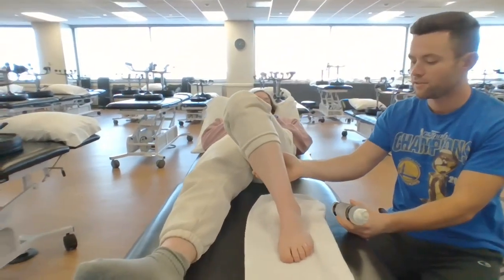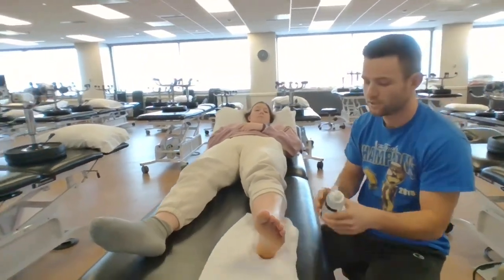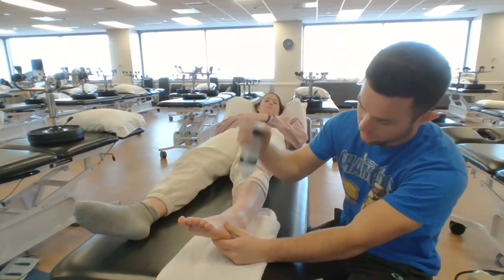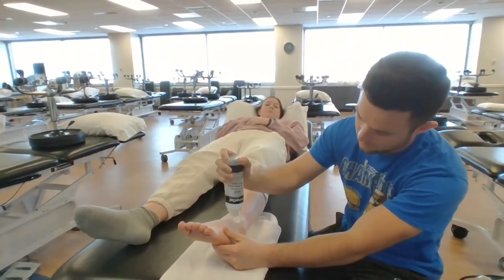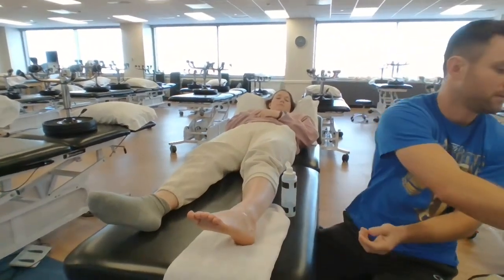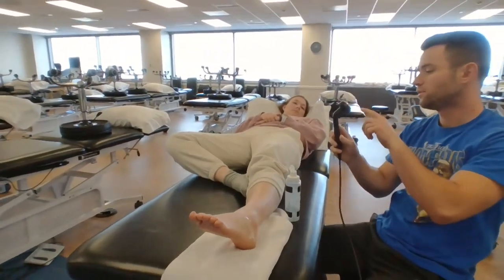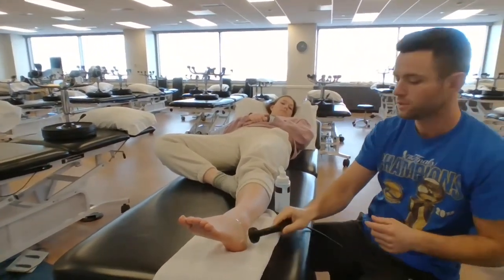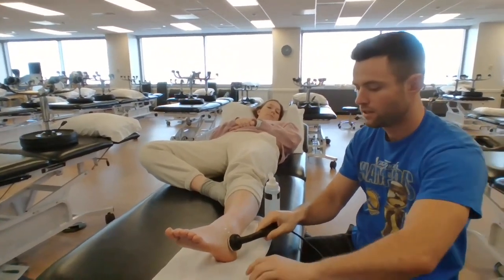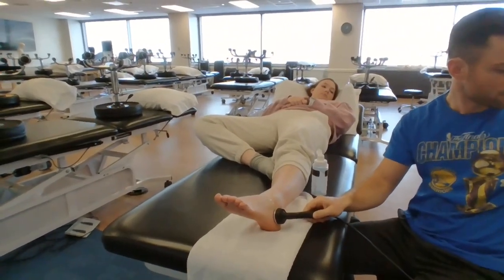And actually, can I have you extend this leg out? Okay. Are you okay there? Are you comfortable? Okay. So we're going to turn this leg just a little bit. We're going to apply that gel there. And then, again, this is what the ultrasound head looks like. So we're just going to put this on here. The machine's not on yet. Don't feel anything. Okay. Now we're going to go ahead and turn this machine on.